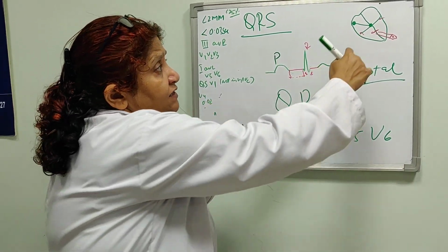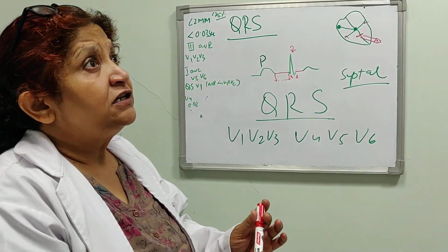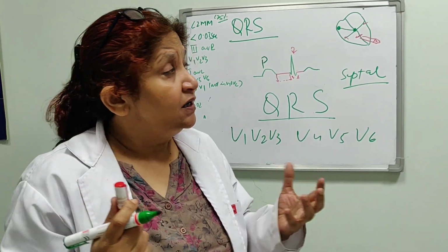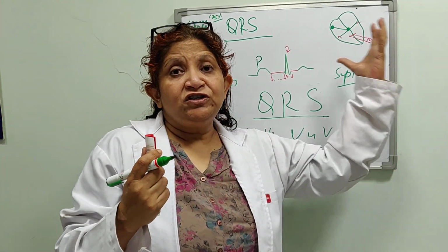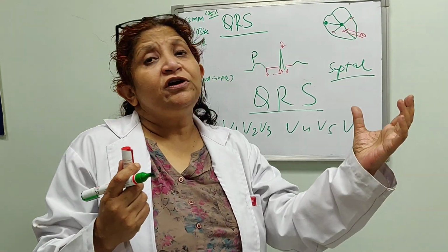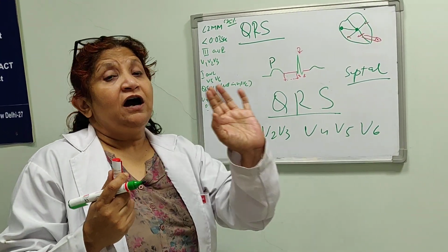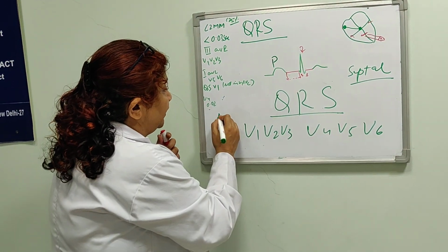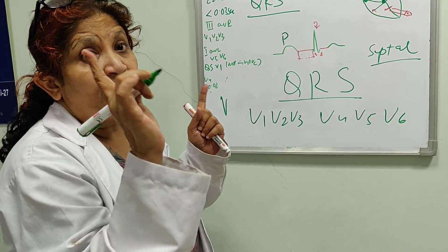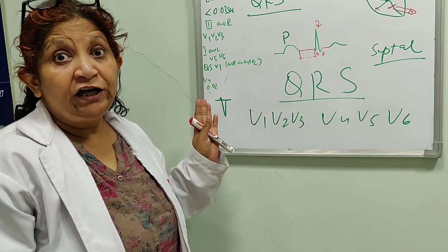And then there is the major ventricular depolarization. So both ventricles are contracting. Since the left ventricle is the most prominent and powerful muscle, the major ventricular depolarization is leftward and downward. So the second part, the major ventricular depolarization, is sensed by V1 as going away from it, so it will record a deep S wave. So a very teeny mini R wave, which is the septal depolarization, and then an S wave, right? So it is not recording any Q wave.